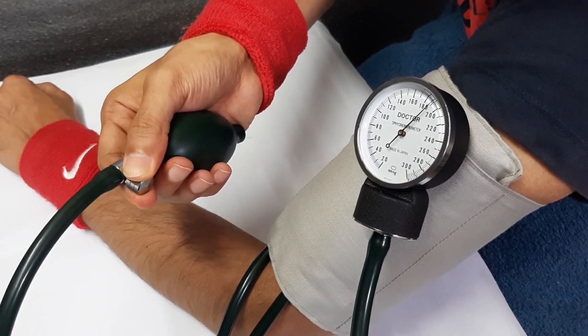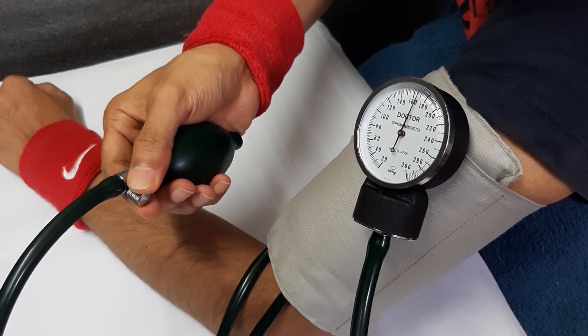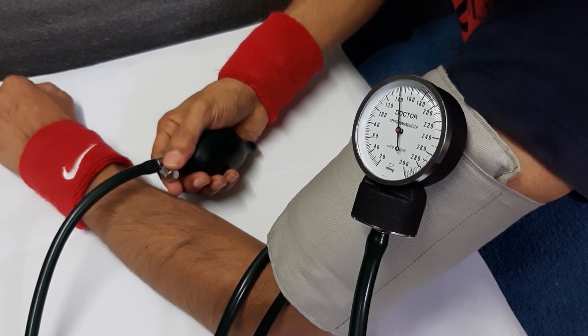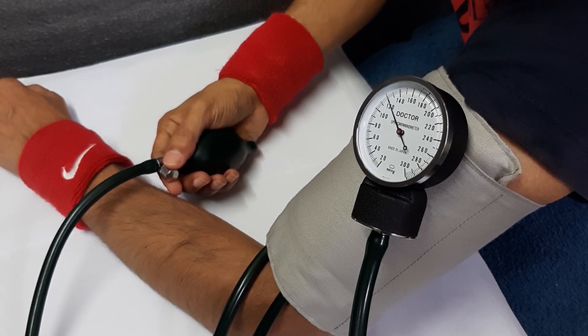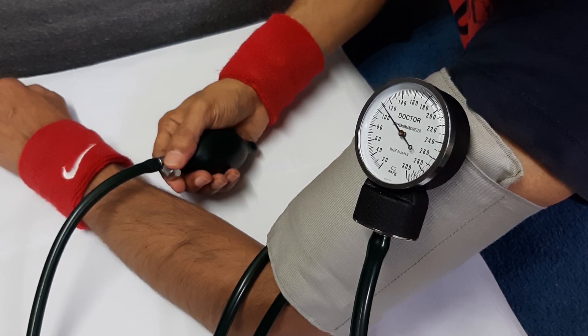Then slowly release air using the pressure control screw, and the needle begins to move slowly. You can use a stethoscope to listen for Korotkoff sounds, or thumping sounds. You can also watch the needle fluctuating up and down — this is the systolic pressure, or highest pressure.